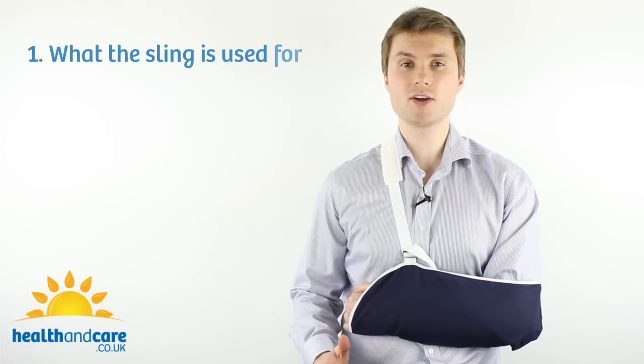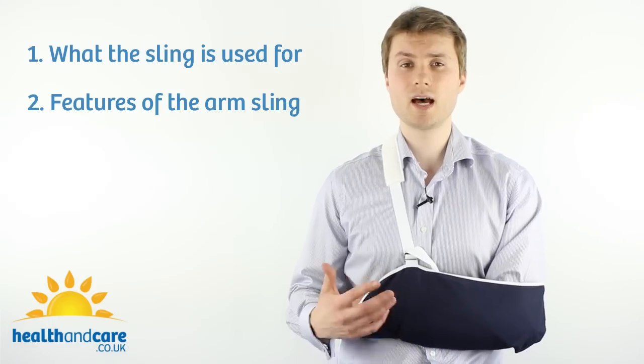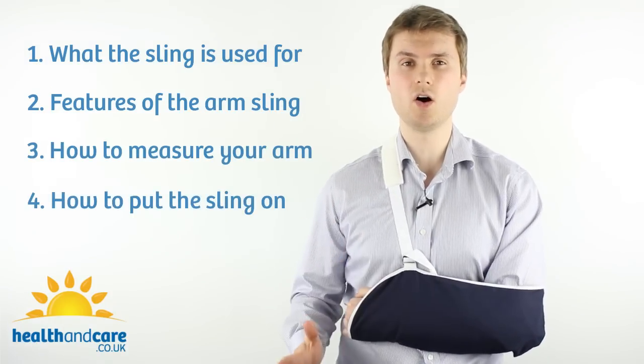First of all I'm going to talk about what the Cotton Arm Sling is used for. Then I'm going to talk about a few of the features of the Cotton Arm Sling, including what it's made from and how to wash it. And finally, I'll be demonstrating how to measure your arm to get the right size sling and also how to put the sling on.